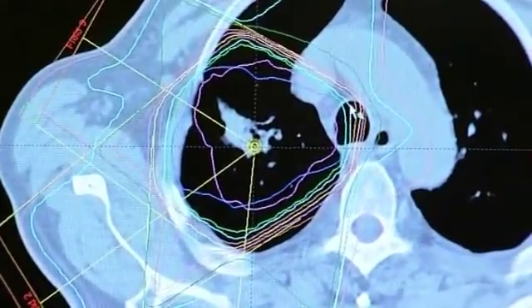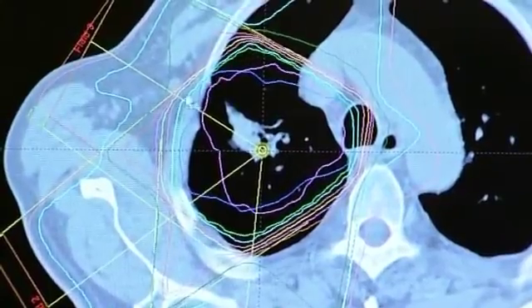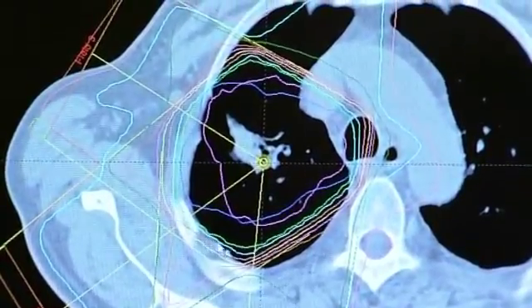This cyan color is representing 95% of a dose. This is what the doctor has asked the PTV to be covered by.